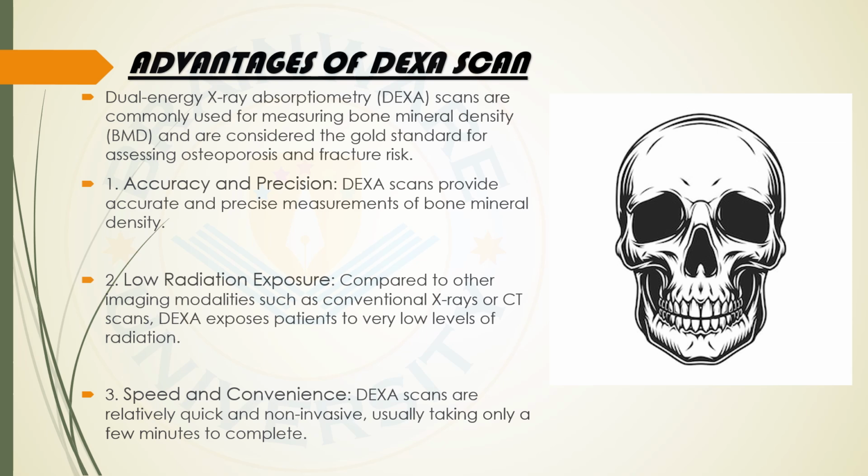The number one advantage is accuracy and precision. DEXA scans provide accurate and precise measurements of bone mineral density, and they also use low radiation exposure. That means if we compare it with other modalities like CT or fluoroscopy, they have much higher radiation than the DEXA scan. And it is also speed and convenience. That means DEXA scans are relatively quick and non-invasive, usually taking only a few minutes to complete, which makes it more acceptable for the patient to go through a DEXA scan.